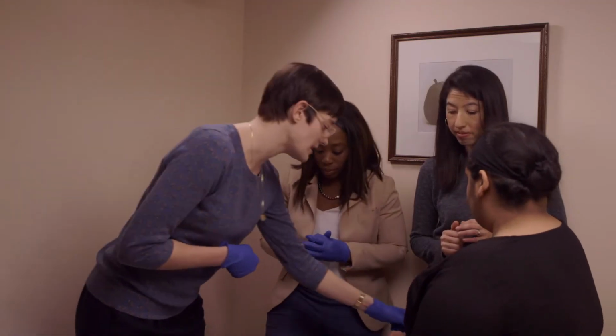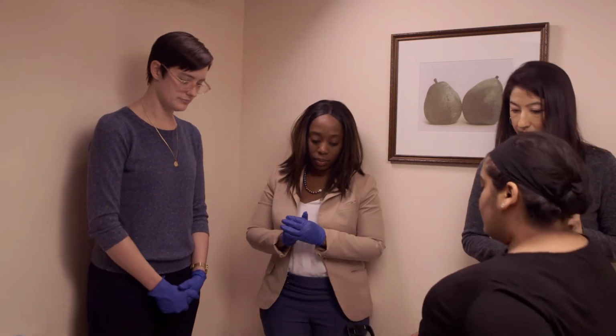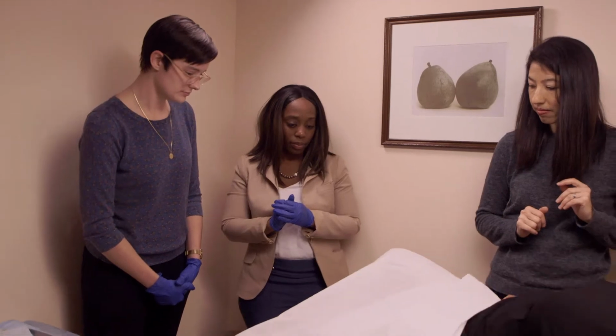So the first thing we're going to have you do is get into position. You're going to move your bottom to the edge of the table, and you're going to put a foot in each of the footrests here. Okay. I'm just going to adjust this a little bit. Thank you. And how is this position? It's okay. It's fine.